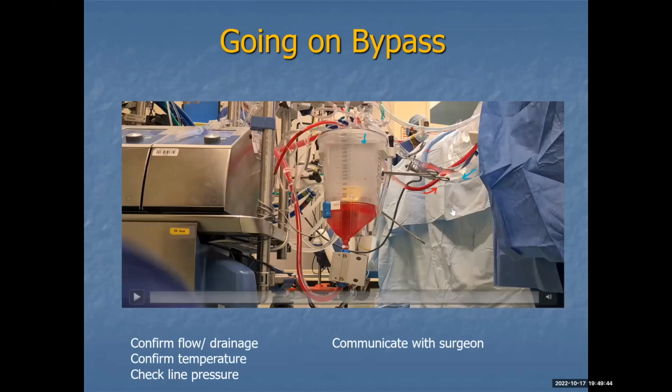Anyway, so we've done our arterial cannulation, we've done our venous cannulation, and the final stage after building all that is to go on bypass. So if we look here, the key thing is your drainage, or your deoxygenated blood, is going to drain into our reservoir, our atrium here. It is going to get pumped by the pump here using a flow of 5.1 litres, because it's our patient from earlier, that's 100 kilos, and it's going to get pushed into the oxygenator at the back, and from the oxygenator the oxygenated blood will be returned back to the patient.